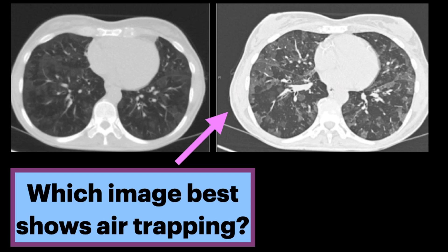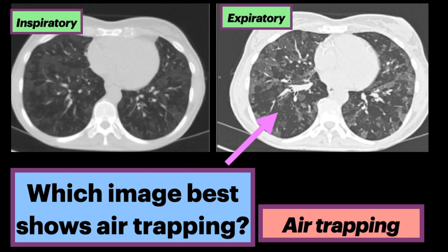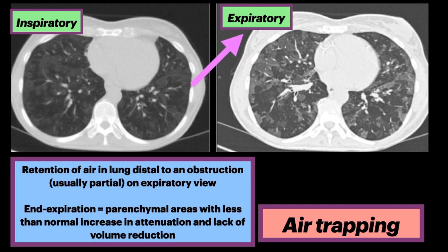Which image best shows air trapping? The right-hand image shows the expiratory view; the left-hand image shows inspiratory. On the expiratory view, we see absence of increased attenuation and lack of volume reduction in certain parenchymal areas of the lung. Thus, the answer is expiratory.